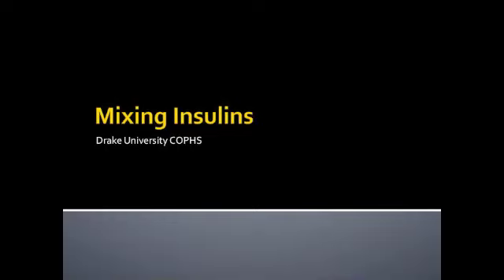This demonstration is provided for patients with diabetes with needs for insulin injections. In order to properly manage insulin therapy, patients may be required to mix different types of insulin in order to meet their body's needs. In this demonstration, we will discuss the different insulin types, general information about mixing insulin, and the proper technique needed to mix insulin.